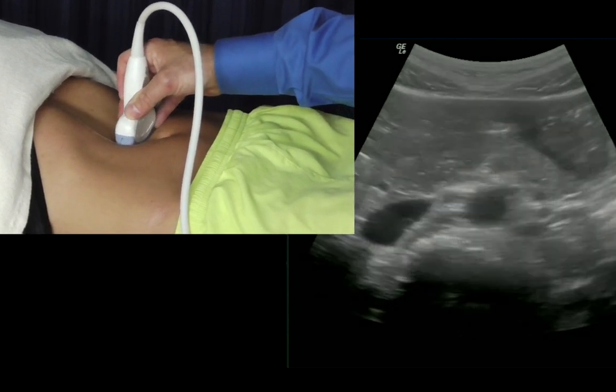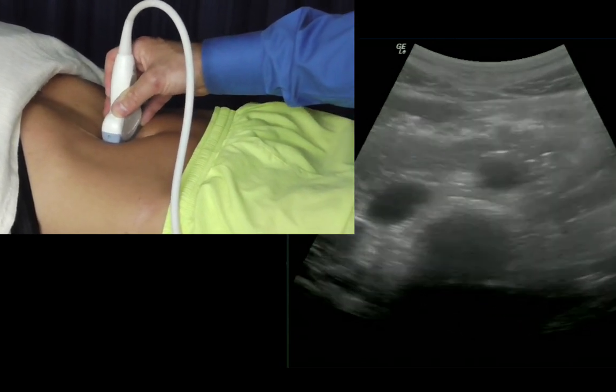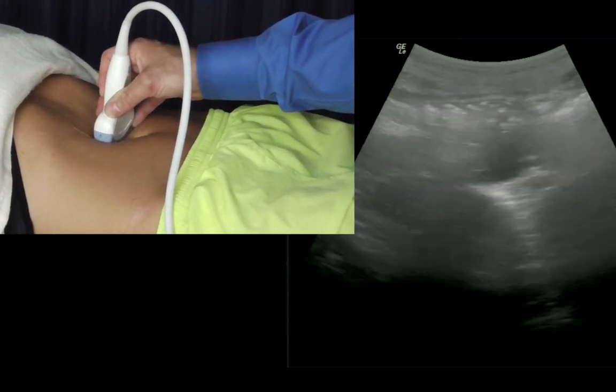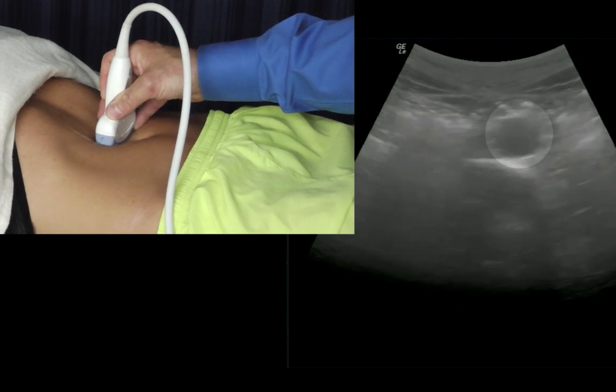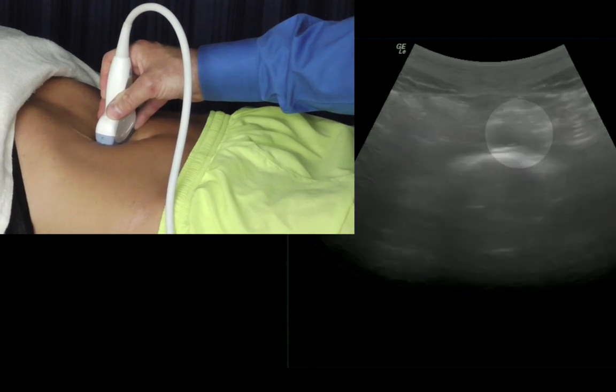As we go distally on the aorta, no more branches of the aorta are visible using ultrasound until we get to the bifurcation of the aorta into the iliac arteries.